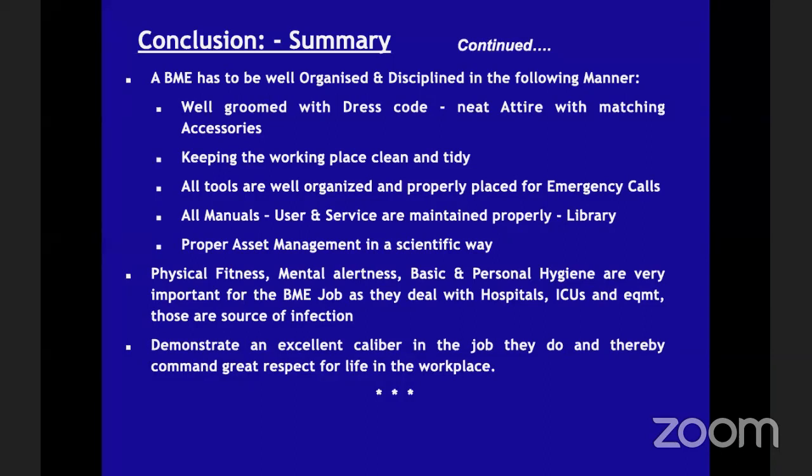All equipment coming to the hospital needs to be checked for its performance with the test equipment. Equipment is manufactured somewhere in some country. The quality, they say, is okay when it is leaving the factory. After leaving the factory, it is being packed. It comes through various countries, various airports, various ground handling agencies. When it reaches the hospital, the machine may not be okay. It was okay at the site of manufacturing.